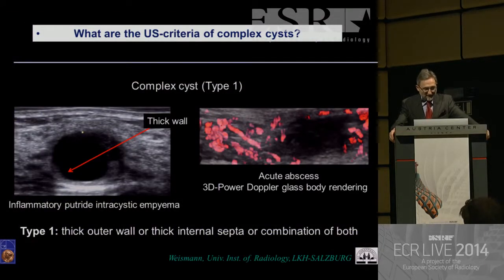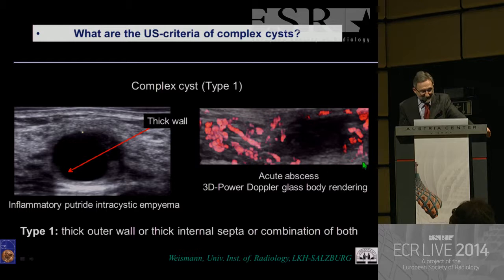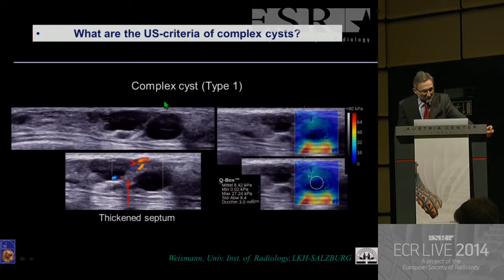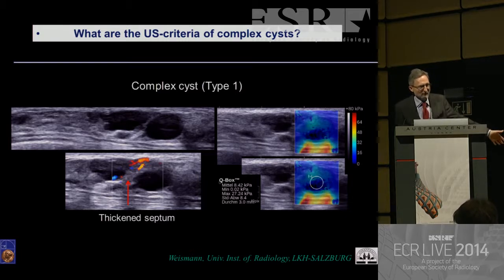A complex cyst Type 1: you see a thickened wall. In this situation, the arrow indicates the thickened wall — this is an inflammatory intracystic empyema, and you can also see hypervascularization surrounding this abscess. This is an acute abscess. Another example: a thickened septum with large fluid-filled areas. The thickened septum shows vascularization on color Doppler. This is complex, with a definitely higher probability of malignancy than 2%, placing you in BI-RADS 4.